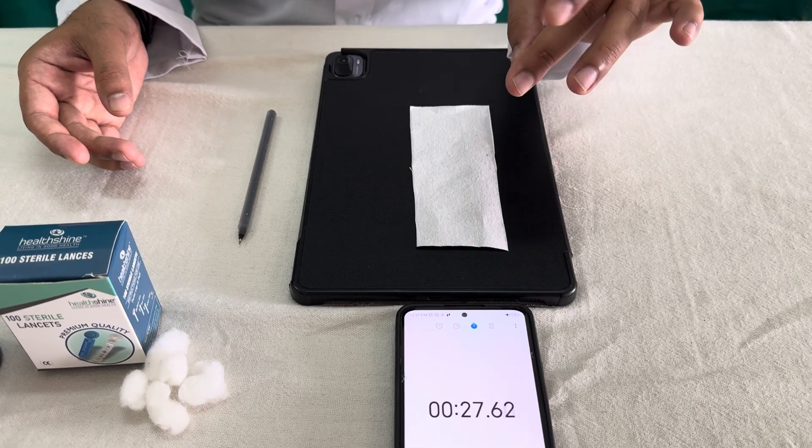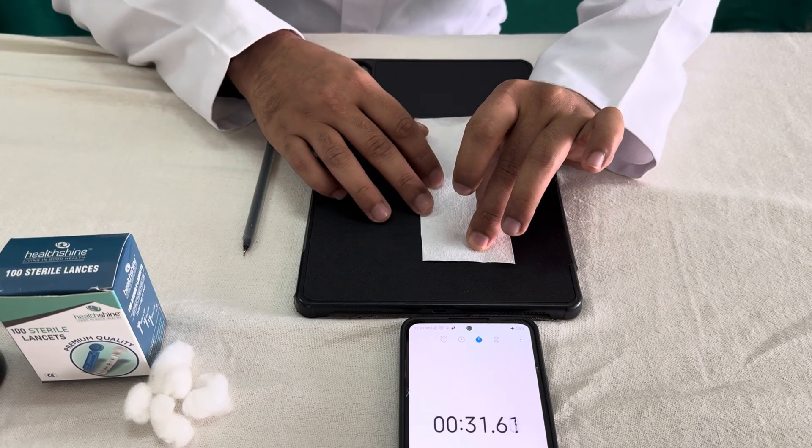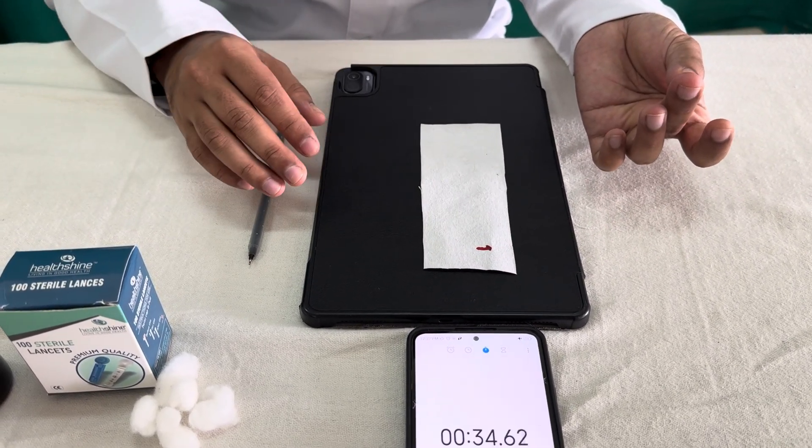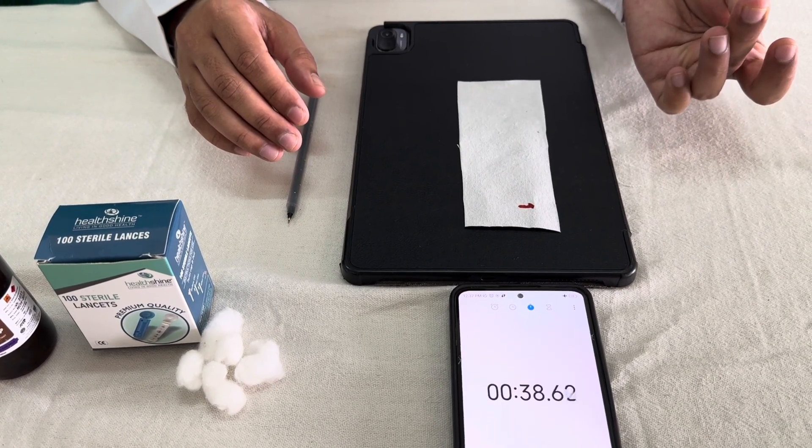At nearly 30 seconds, we need to just touch it. You should not press it too firmly, so that the free flow or the spontaneous flow should come. Now I am waiting for the next 30 seconds.